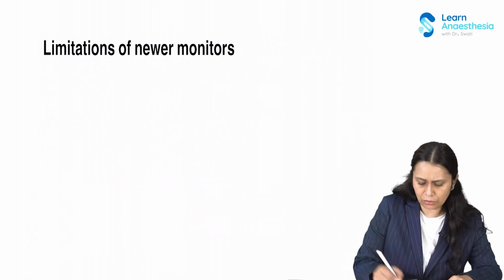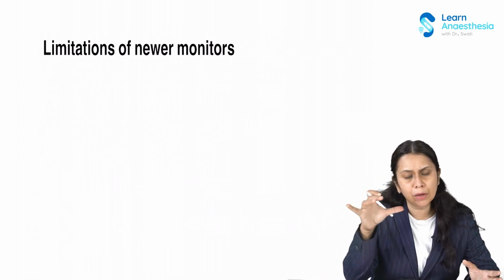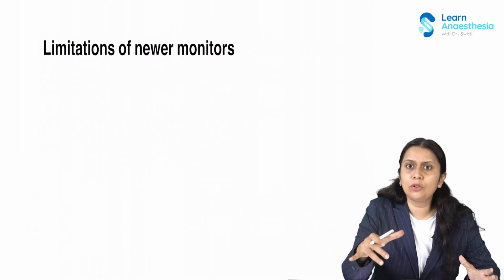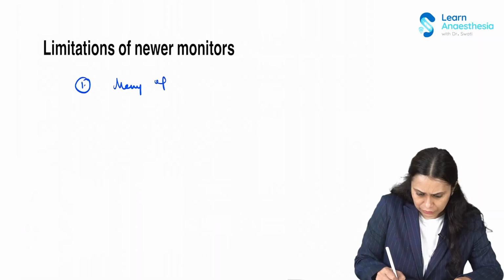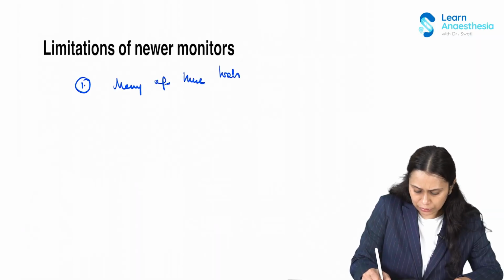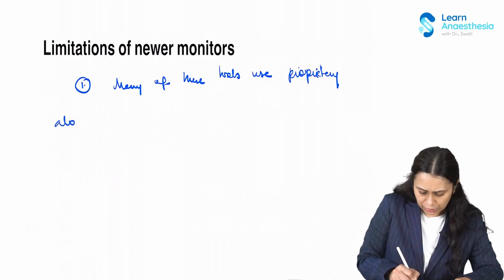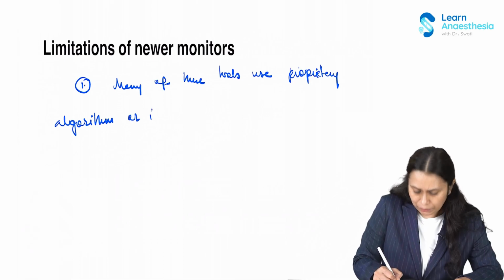Now, the first limitation of these newer monitors is that a lot of the parameters they calculate are based on proprietary algorithms, which are again not standardized. So many of these tools use proprietary algorithm or imaging, making it difficult to confirm their validity.